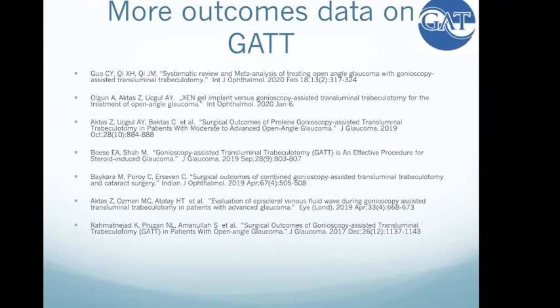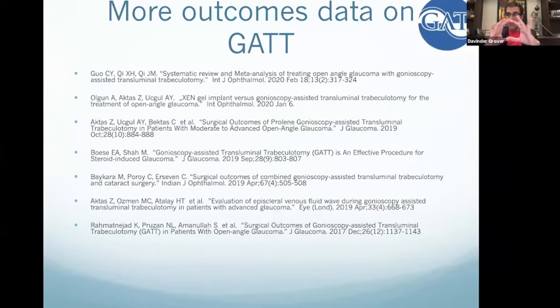All right. So there's a video on my YouTube channel where before I do the surgery, outside the eye on the surface, and I'll show this next week, before I put the suture in the eye, I'll put it on the surface of the eye and figure out the circumference of the canal with the suture, and then I'll mark it, and then I'll bend the suture so that when I'm passing it, if I see that bend and I don't see my suture coming around, I know I've gone too far. So that's another option.